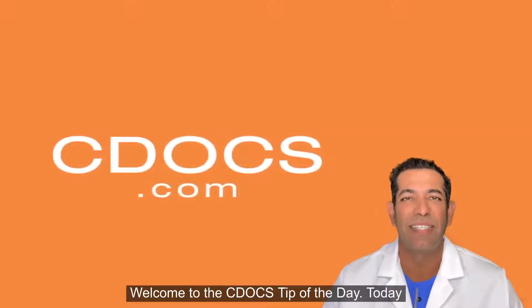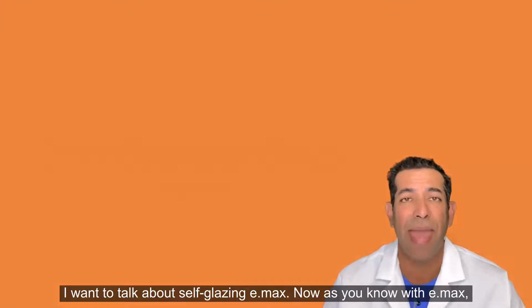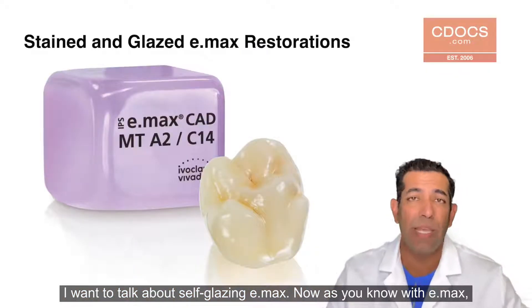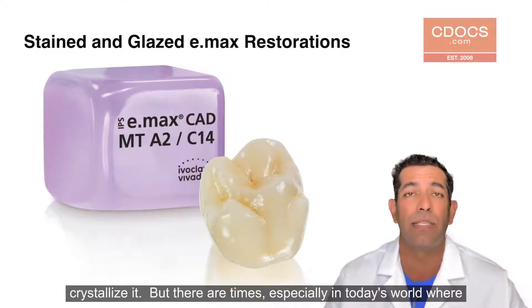Welcome to the C-Docs tip of the day. Today I want to talk about self-glazing eMax. Now as you know with eMax we can stain and glaze the restoration at the same time that we crystallize it.